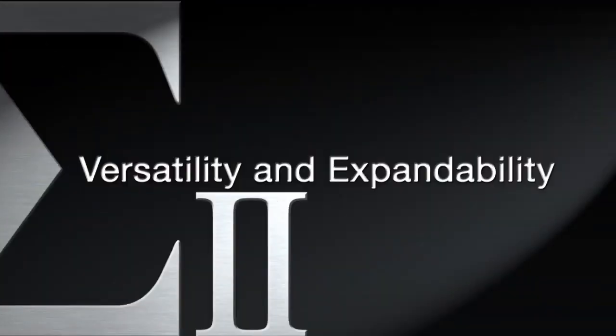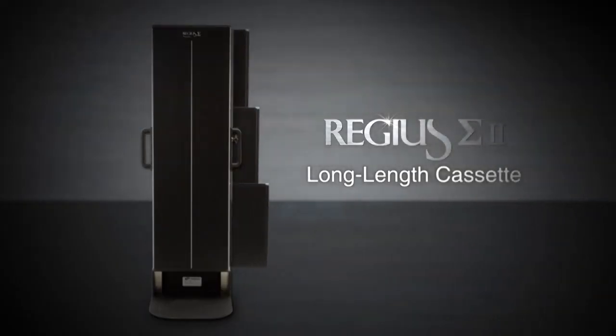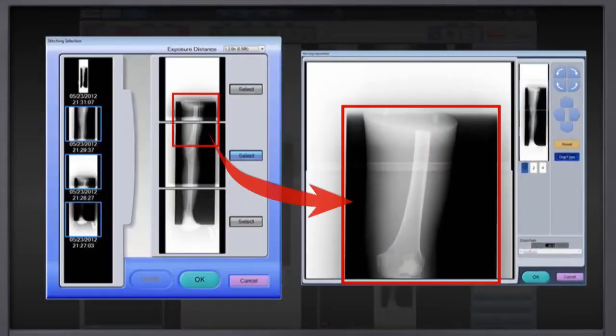ImagePilot has many more features and capabilities that assist with imaging workflow. The long length cassette houses up to three 14 by 17 CR plates to capture the entire length of the spine or leg simultaneously. The stitching software on the ImagePilot then automatically and seamlessly joins these individual images as one composite image.